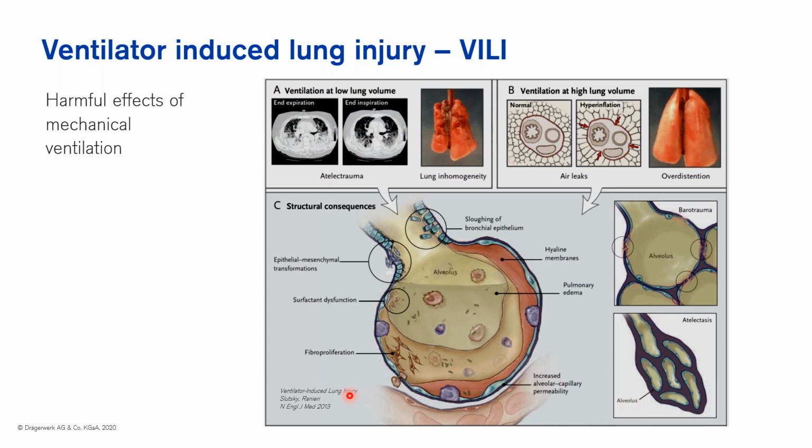Mechanical ventilation has been in use for a long time, with different modes, but since about the 50s, clinicians started to look at what the major contributors to ARDS and ventilator-induced lung injury are. And they compared different strategies on how to ventilate their patients.